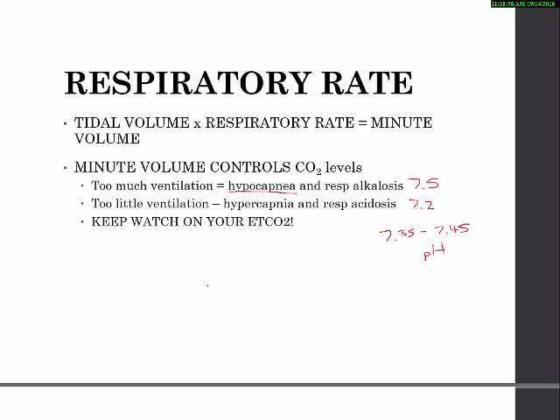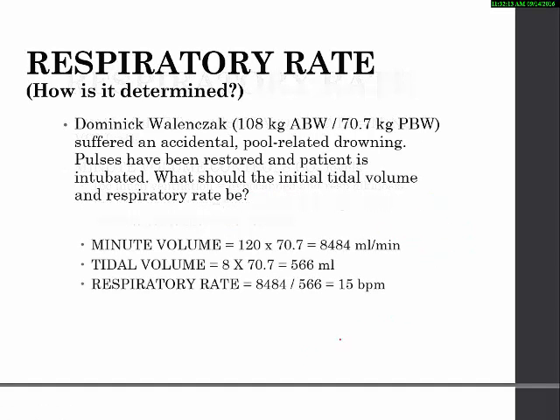Once you're intubated and you're having somebody breathe for you, it becomes that person's job to make sure that stays put. So the takeaway here is when you have intubated patients, you need to keep watch on your CO2. If you see significant changes on your EtCO2, on your waveform capnography, we need to address those things. This is the real science behind determining how much air is getting in the patient and how many breaths per minute.